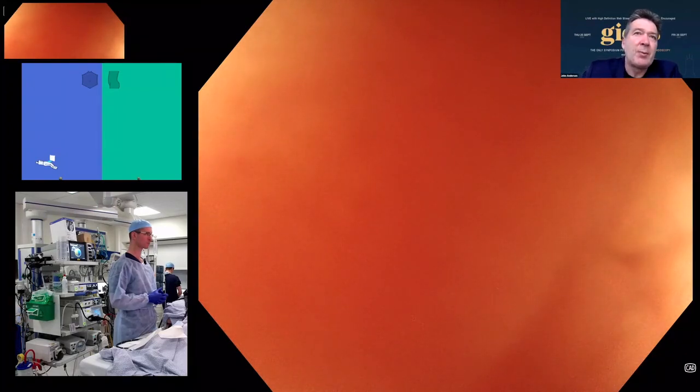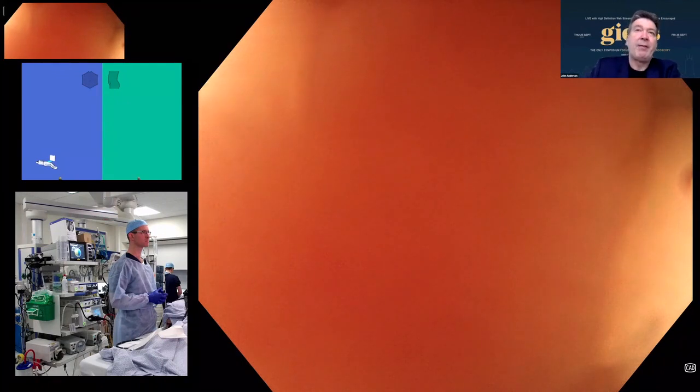The paradox is with surgery around the rest of the bowel, where often the mesenteric attachments have been taken down to mobilize the colon during surgery. And as you rightly say, the colon can paradoxically become very, very mobile. And actually a fatter or a stiffer scope, an adult scope, is more beneficial. But you have what you have. This may or may not be a relevant factor.